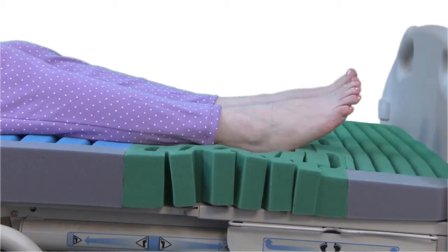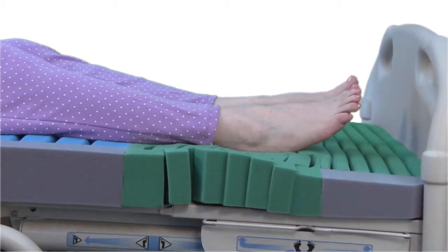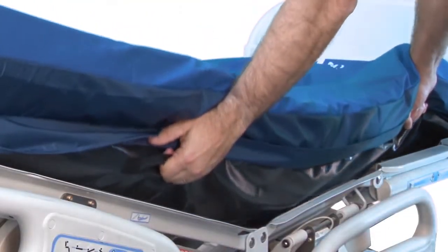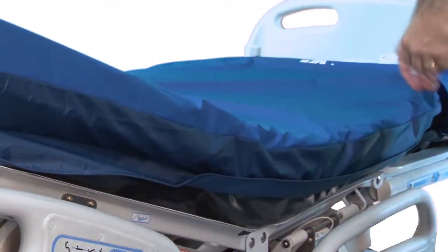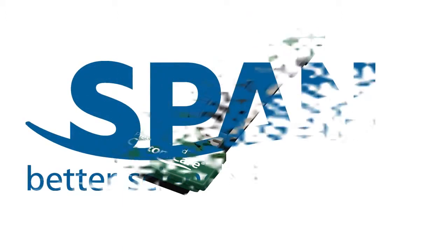A compressible section allows comfortable accommodation of multiple lengths and foot positions. Durable fabric handles simplify mattress placement. The recess deck Custom Care from SPAN in America, where better science means better care.